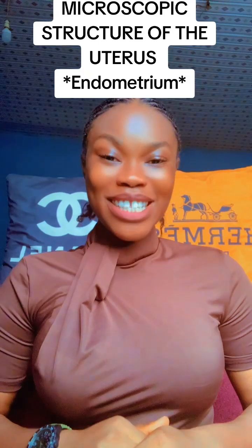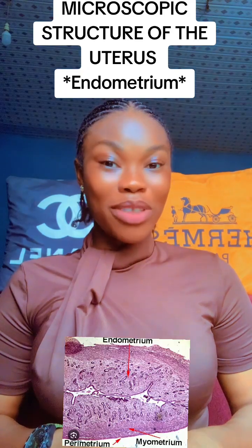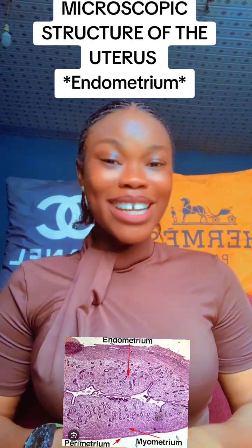Ladies and gentlemen, I am Steph Max, and this is the microscopic structure of the uterus, precisely the endometrium.